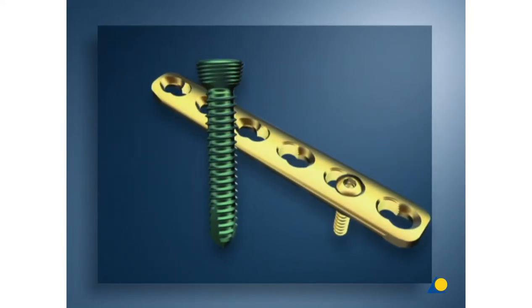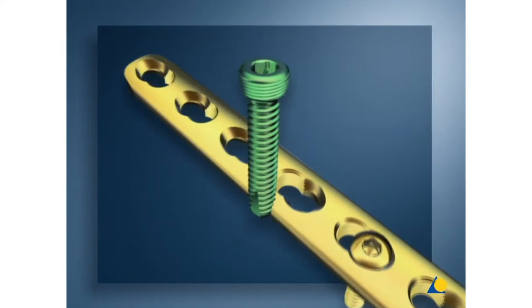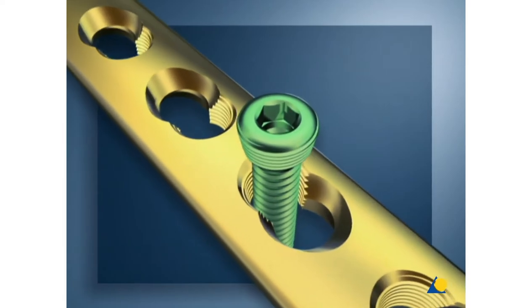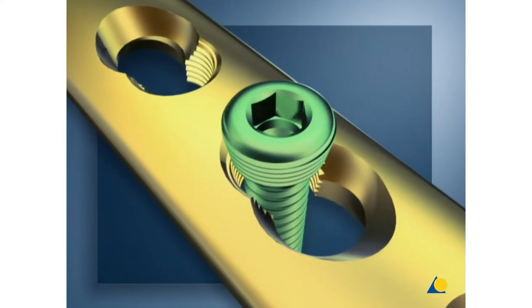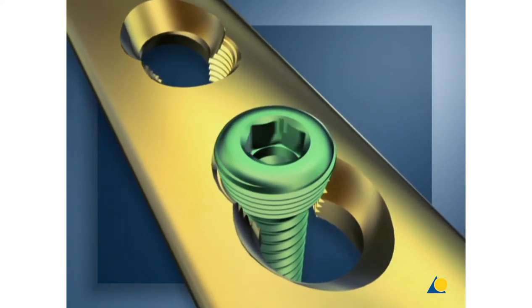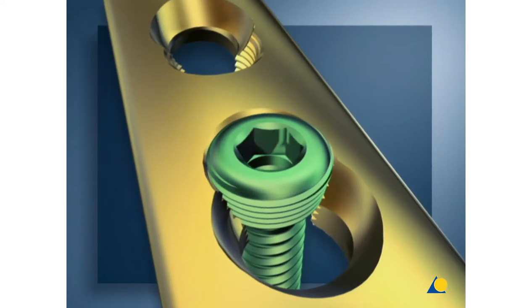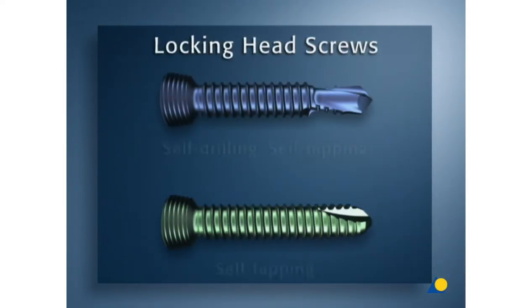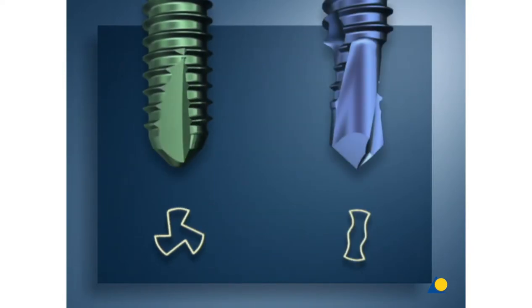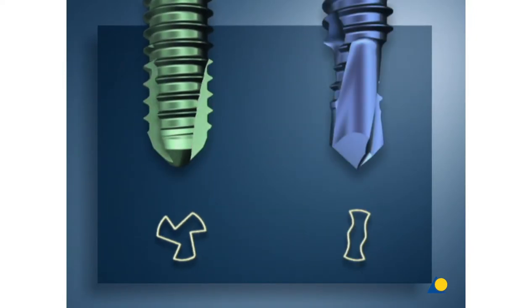The 5 millimeter locking head screws are only used in combination with plates. The locking head screw is inserted in the threaded part of the combination hole. The head itself will lock firmly in the plate when driven home, thus providing angular as well as axial stability. The plate is not pressed onto the bone surface to achieve fracture fixation. A locking head screw is characterized by its threaded head, its larger core diameter of 4.3 millimeters, and a shallow thread. The green self-tapping screw has cutting flutes as well as a rounded tip. This is the screw used for the exercises.